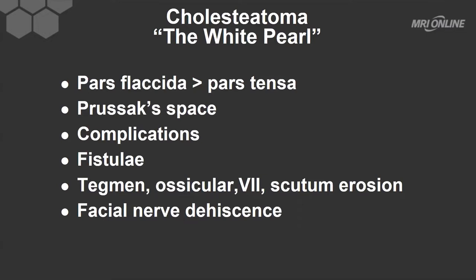From the pars flaccida ingrowth, the cholesteatoma will show soft tissue opacification in Prusac space. Remember that Prusac space is the space between the scutum and the middle ear ossicles. Along the way, that scutum may be either blunted or eroded.